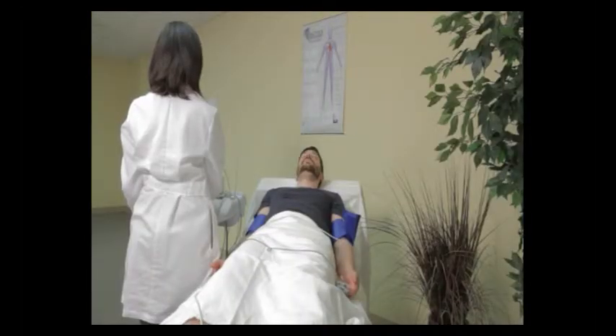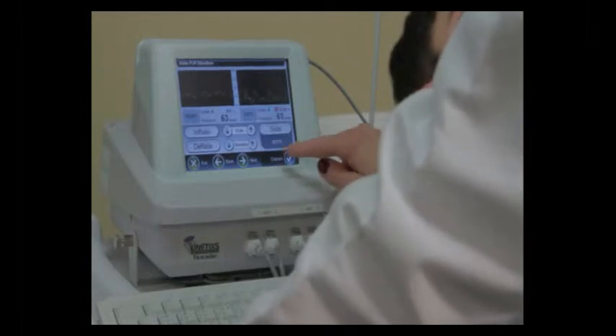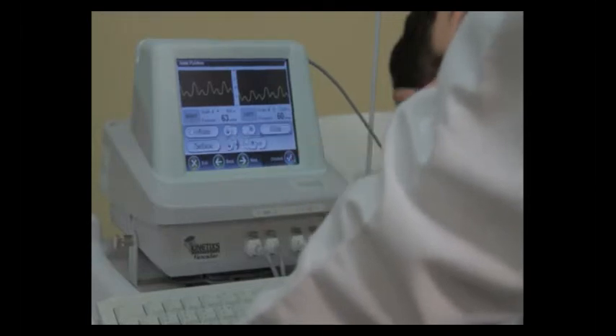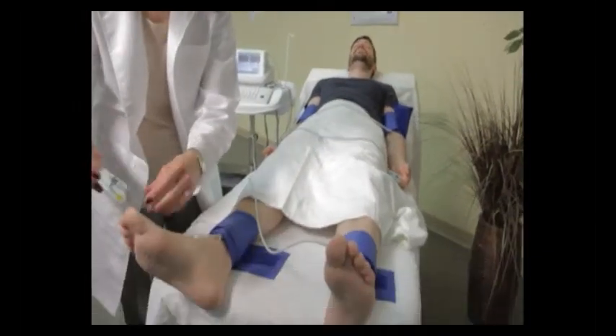With one touch, the REVO will inflate both cuffs to 65 millimeters of mercury pressure. We now see the waveforms are consistent, so we're going to press capture. We're then going to press proceed, and then move the PPG clips from the fingers to the great toe on the left and right foot.